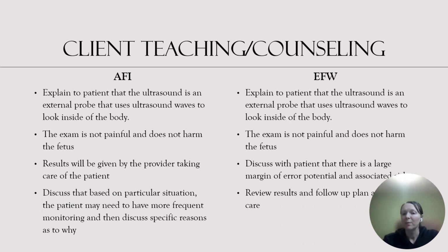And as far as our teaching, it's going to be very similar for both things. We need to just explain to the patient, this is an ultrasound. It's an external probe, nothing going inside the body. This isn't painful to you. It isn't harmful to baby. The provider will go over all the results with you. And then based on the individual circumstances, what their results are between AFI or EFW, there may need to be follow-up, but all that will be conveyed to the patient once the results are in and the provider has been able to go over it with the patient.